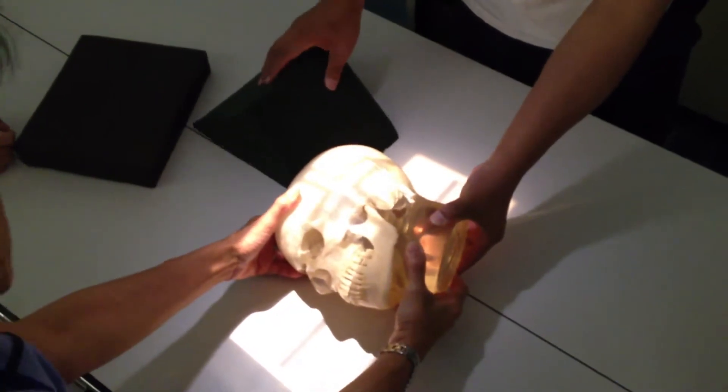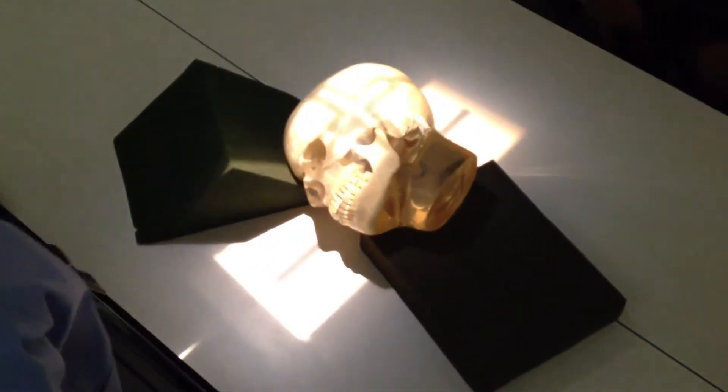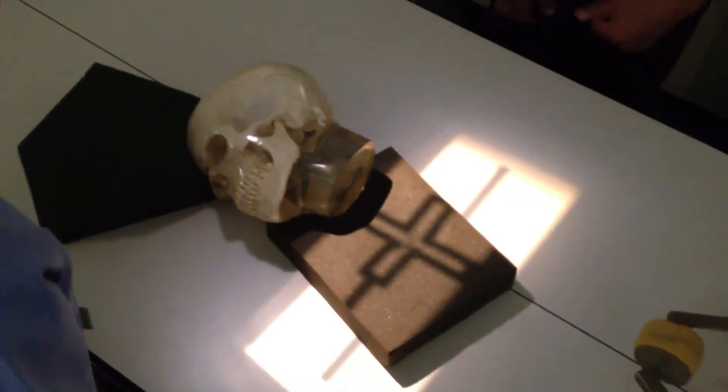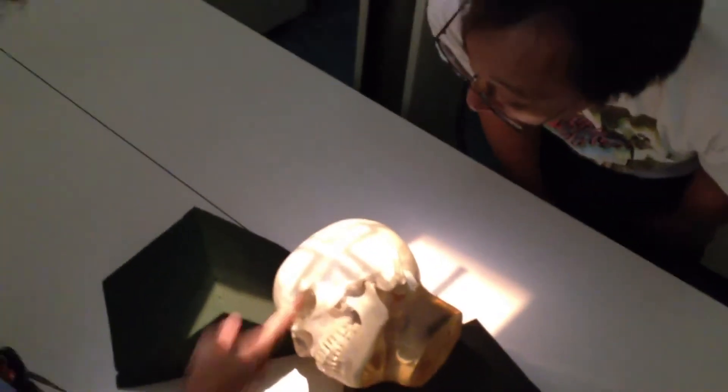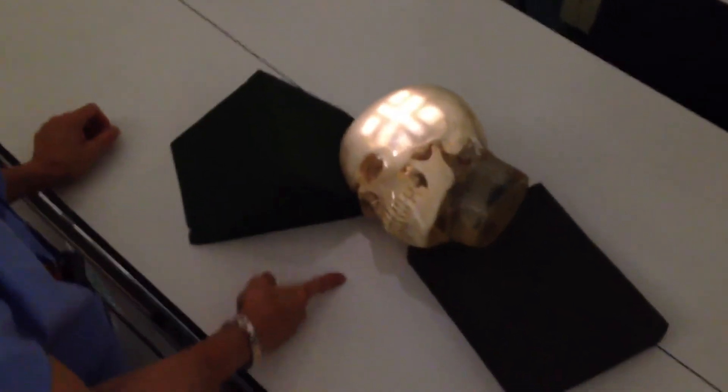For the TMJs, whether it be the Laws or Schullers — well, with Schullers, because there's such a big angle, you're probably going to enter much higher. Let's look at what we have: 15 or 30? We're only concerned with the downside one. So there's 15. But now your Schullers requires 30 — see how much higher it went up? Because of the big angle, but I still exit here, because that's what I need. So you measure it when they're in a lateral position. Most of us have the other TMJ at the same level.